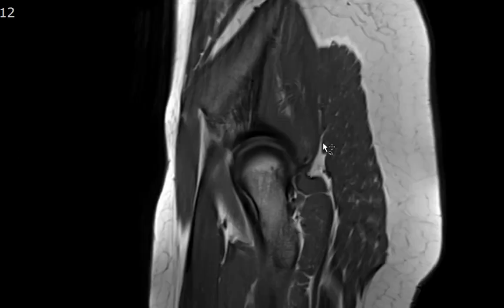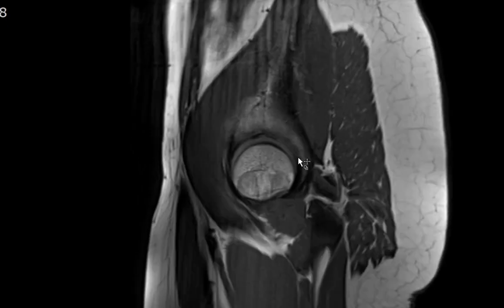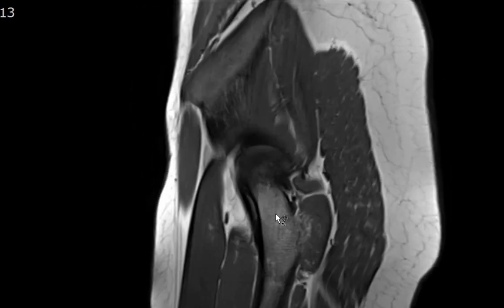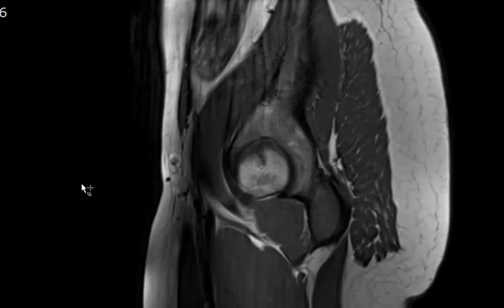I turn to the sagittal T1-weighted images to assess the marrow and muscular bulk, making sure there's no fatty atrophy. The iliopsoas muscle is seen anteriorly and the gluteal muscles posteriorly. Everything looks pretty good.